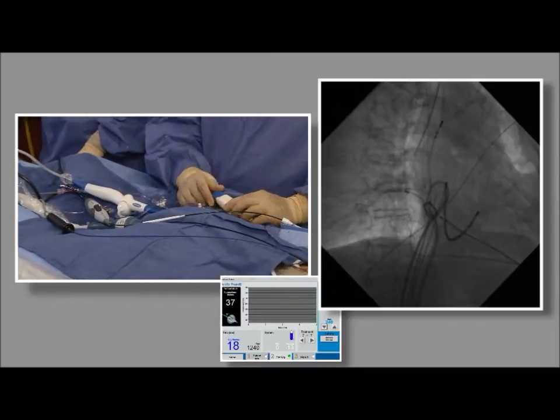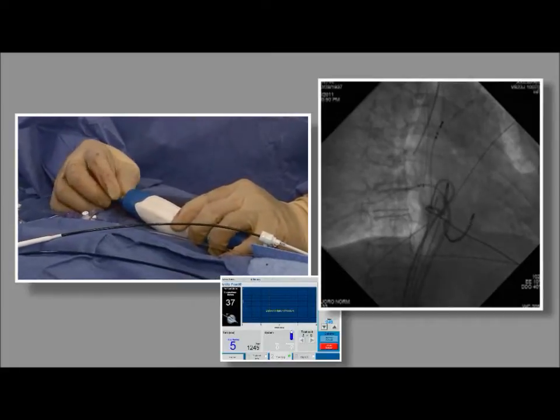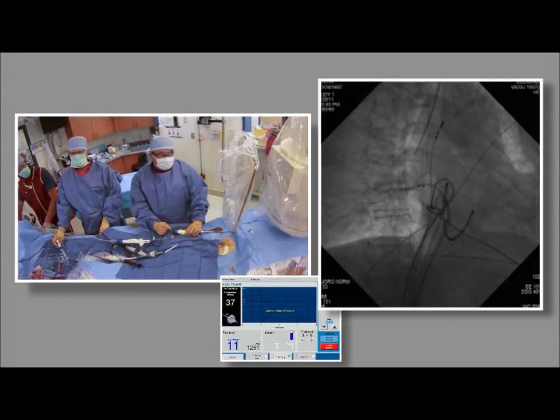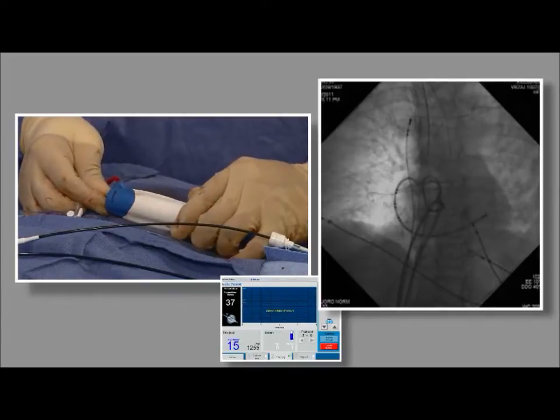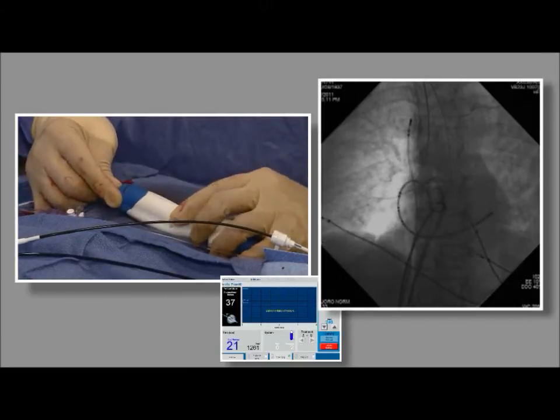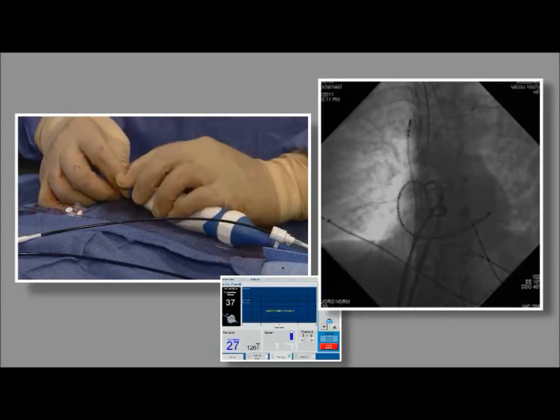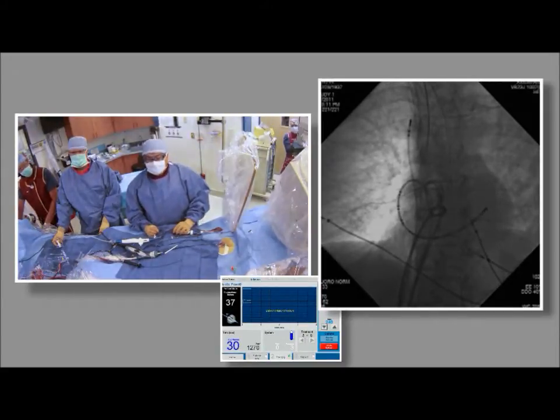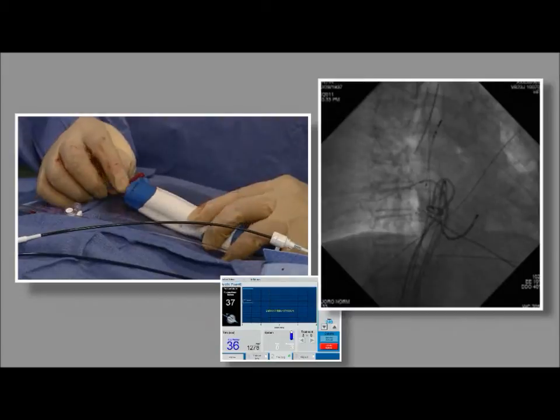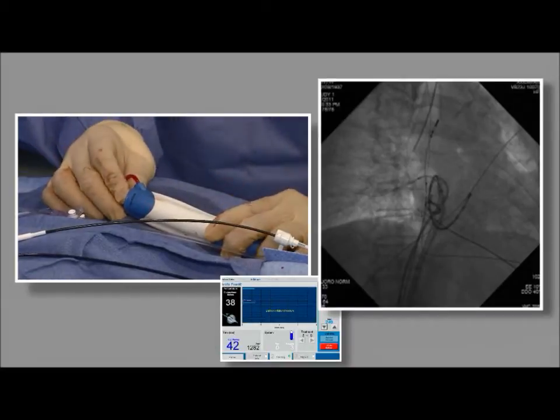Balloon is back up and inflated. Going to LAO again to see the alignment and shape of the balloon. Clocking it one way or the other, you can see how it pulls the balloon in and out of that corner — pushing it in and out can change the angle quite a bit. Back to RAO. The easiest way is to shoot a venogram and see where the leak is. It's very difficult for a large balloon to cover a small ostium, so I know this is going to leak, but we need to see where the leak is.